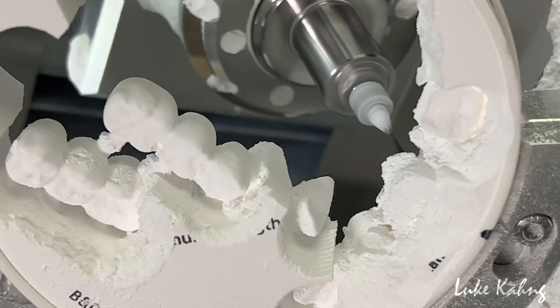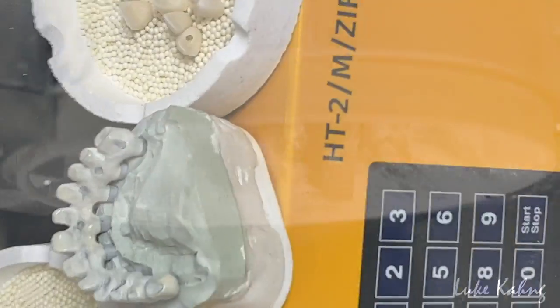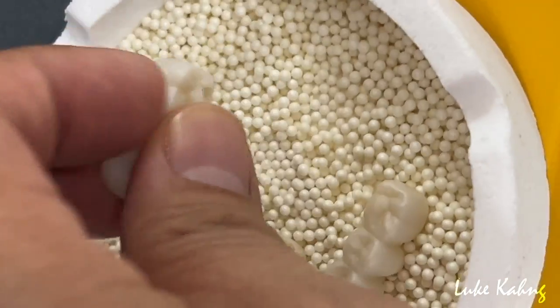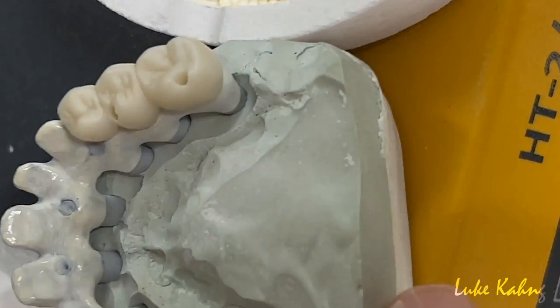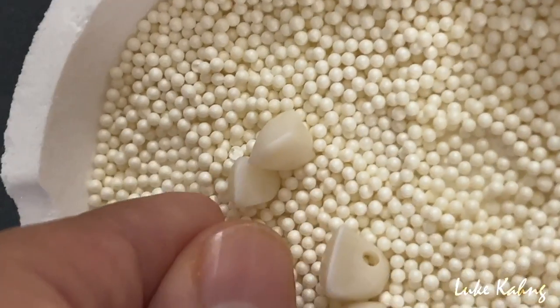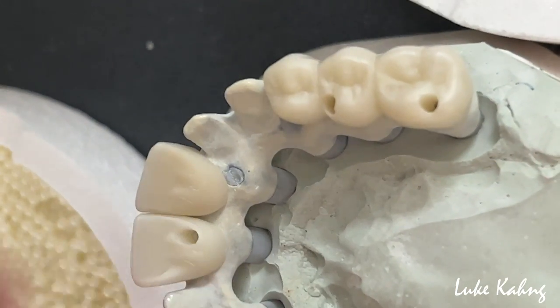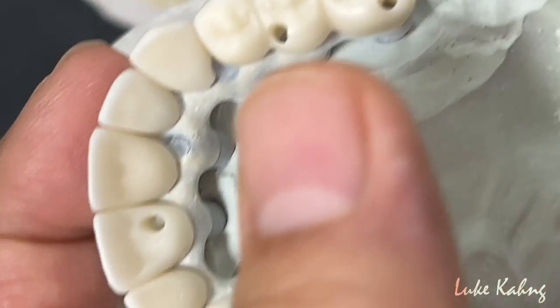Whenever I made one piece, I've done that many times in my past years, and I failed probably 30%. The meaning is we mill or whatever casting, we put the porcelain on top of that and then fuse, okay? So there's no two piece. The problem is whenever the bite is very rigid, it most likely is more cracking, okay? More cracking and damage. But two piece, I don't see any cracking, okay? So from the crowns, we cement together, has a tensile strength, so it's really cool, all right? So that's why I made it.